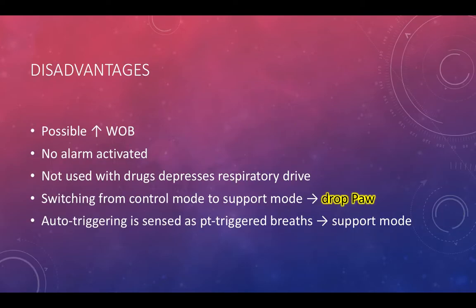Disadvantages: if the patient is triggering the vent but not yet ready for weaning and a support mode, the vent will switch to a support mode, and that could increase the work of breathing. There is no alarm activated when the shift occurs, only a little green icon will be turned on.